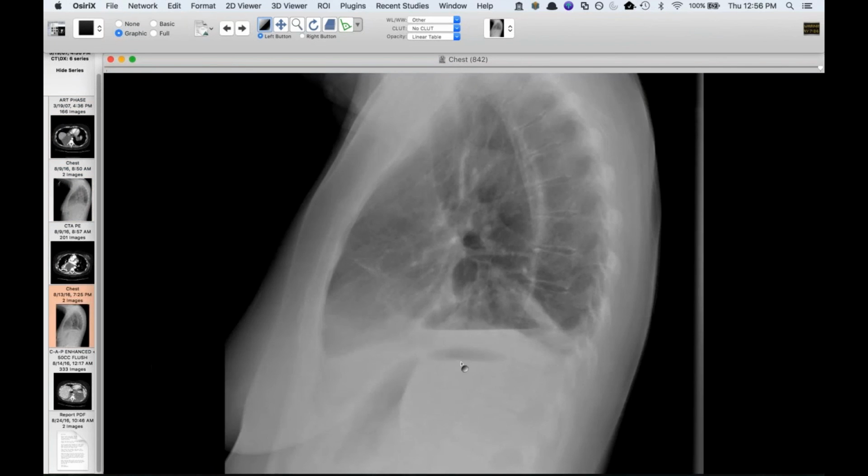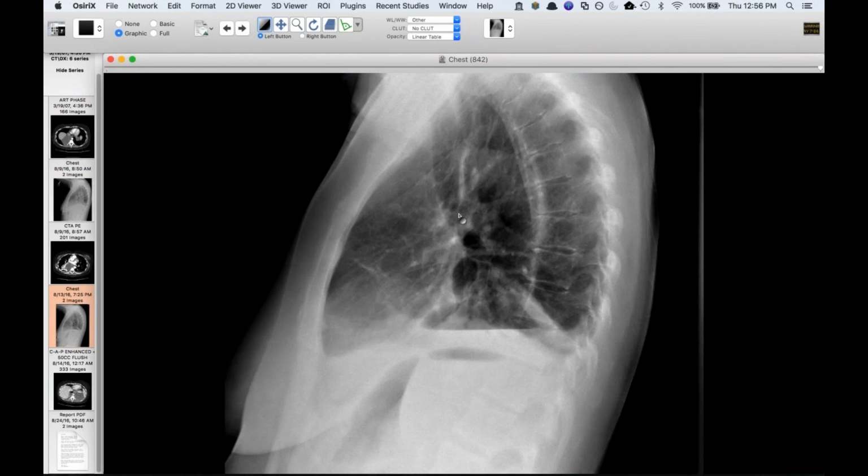And it certainly is in the region that you would expect esophagus and stomach. It's like colon. Yeah, or colon, right. Like an interposition. She's never had surgery. No. Ever have pancreatitis? No, that's what.